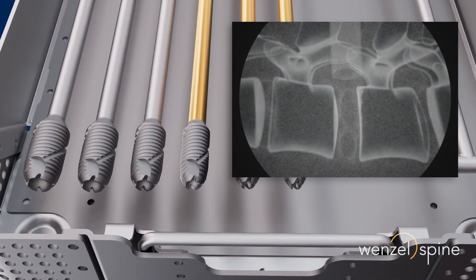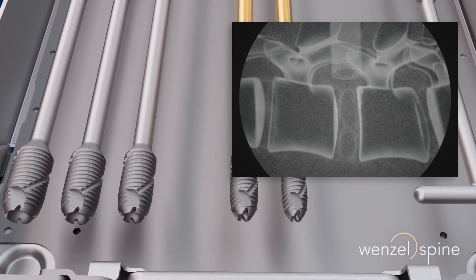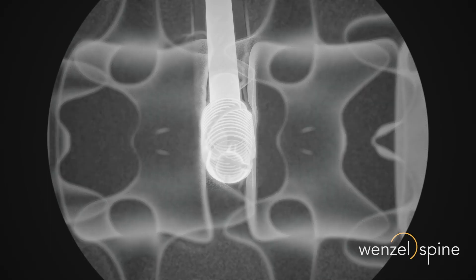The optimal size of the implant is determined using a threaded trial and intraoperative radiographic imaging. The device is checked for proper sizing, location, depth, and orientation with lateral and AP x-rays.